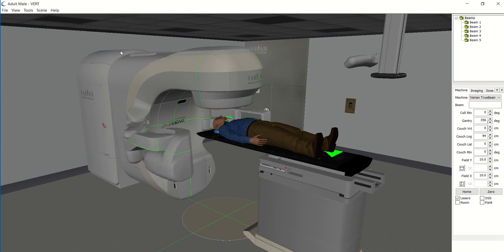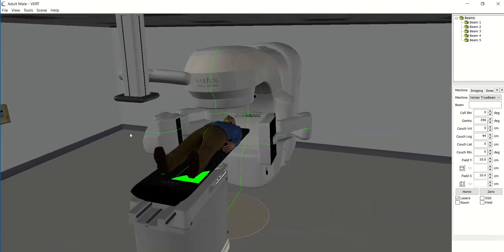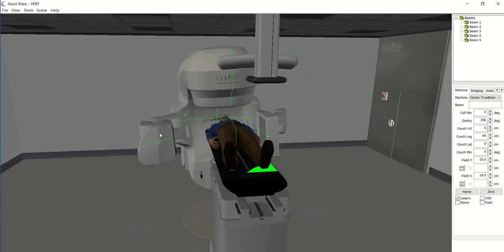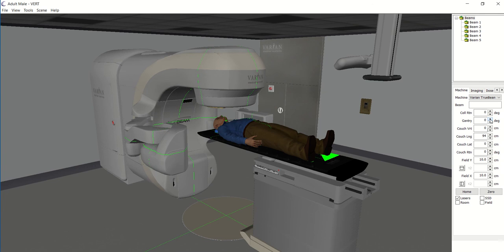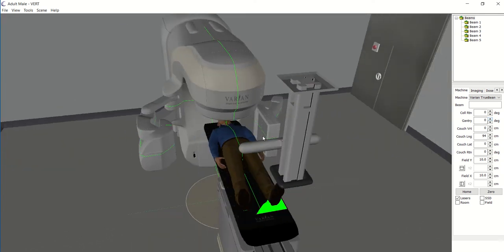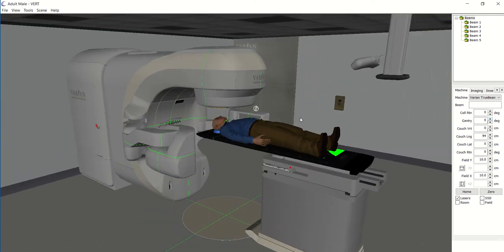Next thing that we can show you are these arms either side of the machine as well. So these actually take X-rays for us, similar to what the diagnostic radiographers do. And we use these X-rays to ensure that our patient is in the right position. So we take these outside the room as well, match it to what we have planned for our patient, make sure they're in the right position, and then that's when we start the treatment. Obviously throughout this, we're talking to our patients, we're trying to build a good rapport, good communication.